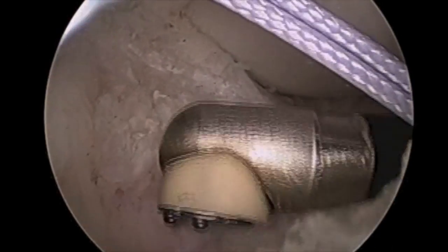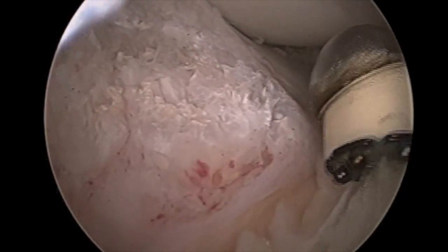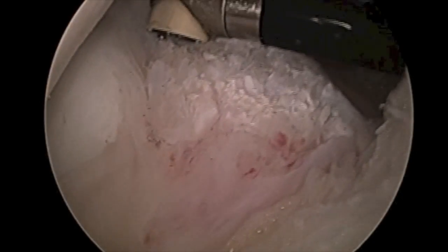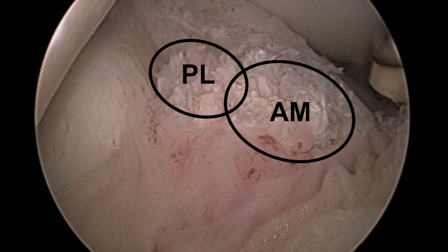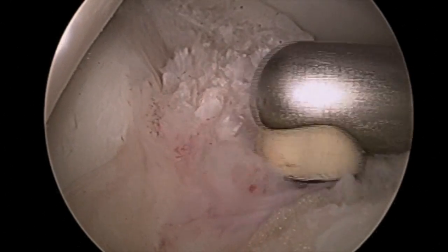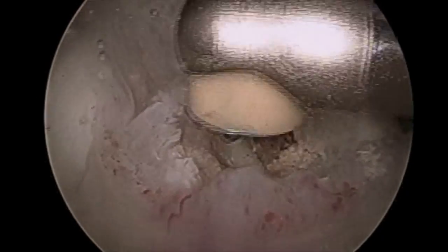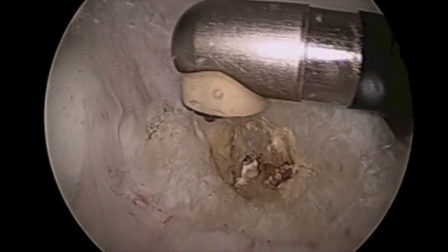Attention is then turned towards creation of the tibial tunnel. The intermeniscal ligament is retracted out of the way, and the arthroscopic wand points to the front and back of the footprint as well as circumferentially around it. In this still shot image, the location of the previous anteromedial and posterolateral bundles of the ACL is visible. An arthroscopic wand is utilized to mark the center of these two bundles for placement of the tibial tunnel guide.